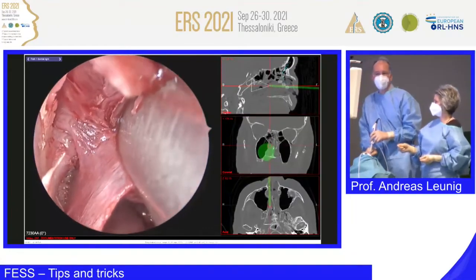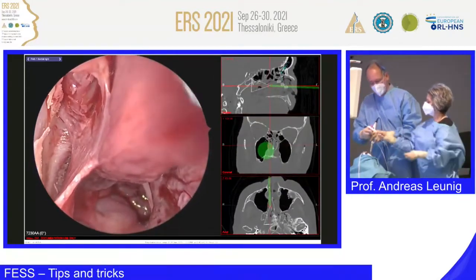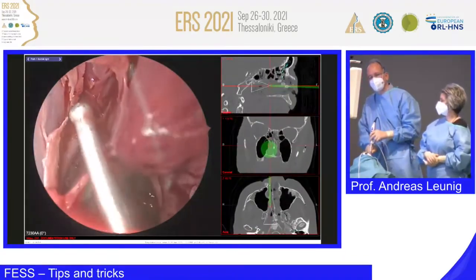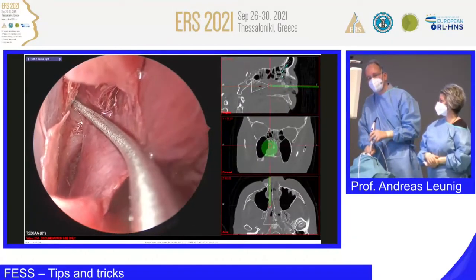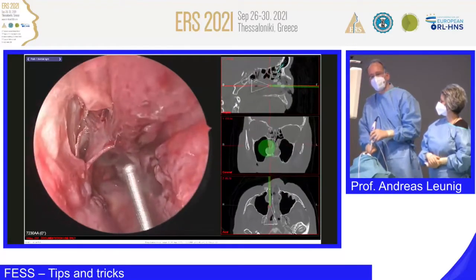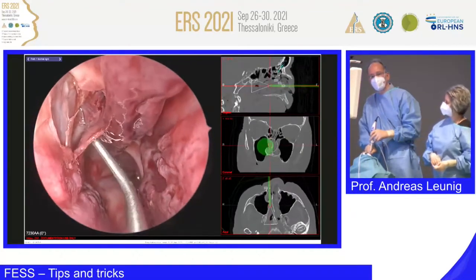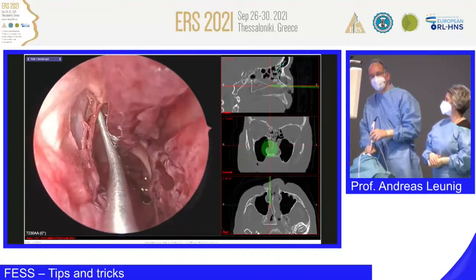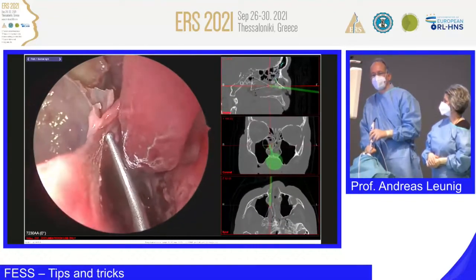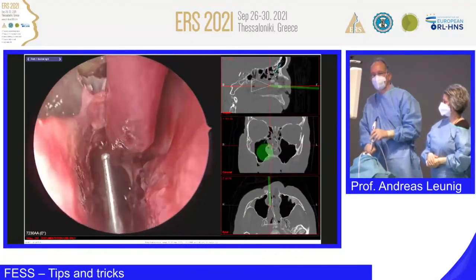And in case it's a bleeder, you can either clip, coagulate or whatever you have to stop the bleeding, but be aware, in case it's still bleeding, maybe the source is not this branch, it is another one. And here you can go into this sphenopalatine opening here. Okay, then when you have done this, I don't like the bony lamellas, usually I take them out. You replace the mucosa here, and you just bring Gelfoam a little bit on it, and that's the procedure. Okay, that's for dealing with bleedings in the posterior part of the nose.